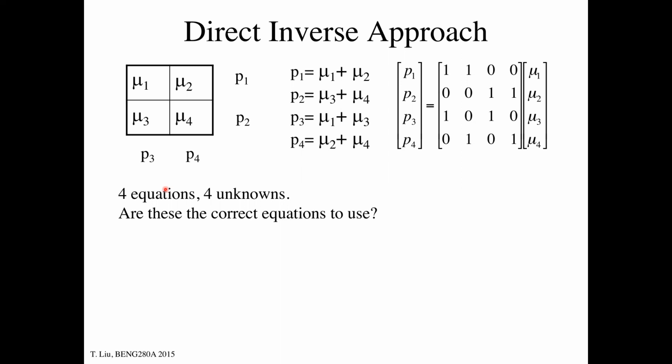It's going to be this and that, right? And it depends on a lot of things. So the X-ray tube can sag a little bit. The X-ray energy coming out of the tube can be modified a little bit, et cetera. And so these things are tuned up, but to get reproducible data, it is imperative that you calibrate the scanner every day. And so that's what the quality assurance phantom is there for.